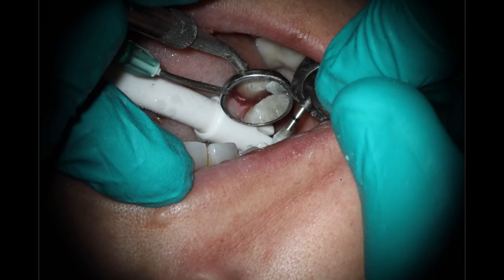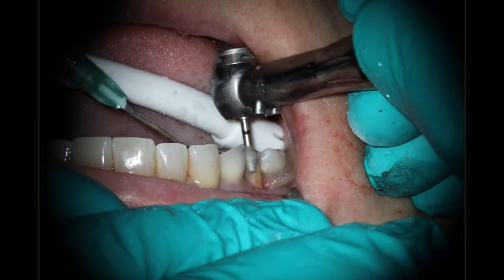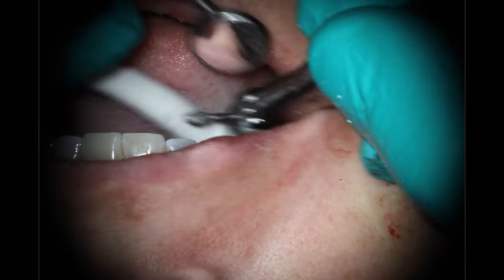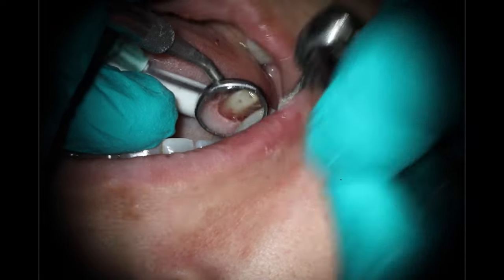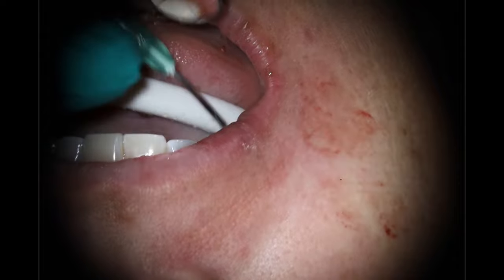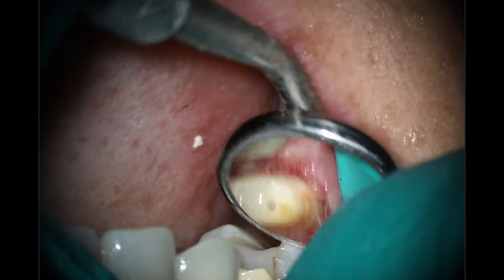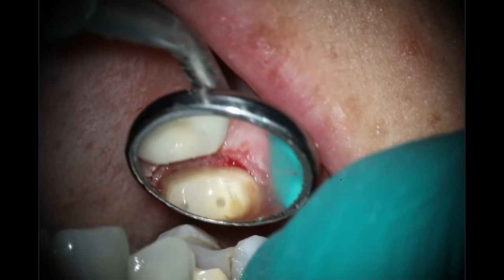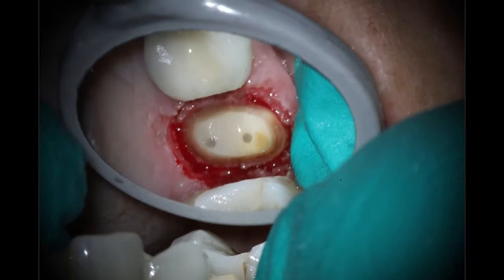That's pretty much all we need to do — finalize the prep, create everything, make it look nice and pretty. I love this burr; I wish I'd had it in dental school. The margins look really nice — they pretty much have draw. You could almost take an impression at this point, but the dentist is a lot better at the restorative aspect than I am, so we'll let him choose the margin he wants. That's kind of what it looks like.